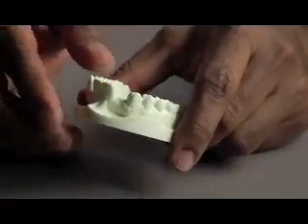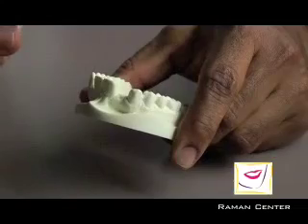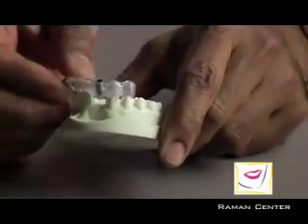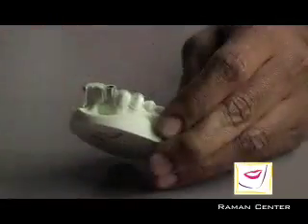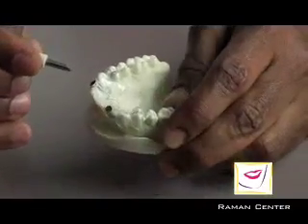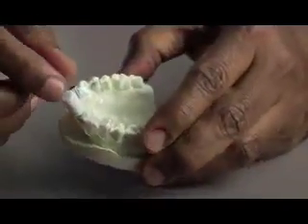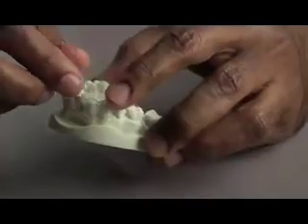With a CT scan, an appliance called a stent would be made that goes on top, and the first step would be to use something like this. This is called a biopsy punch, and it is made so it goes right through that guide. The tissue is removed almost like a divot.